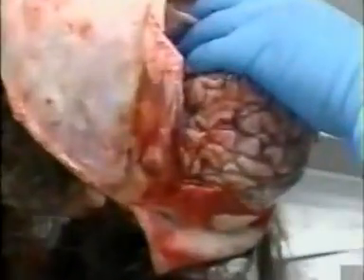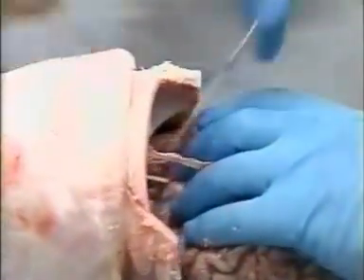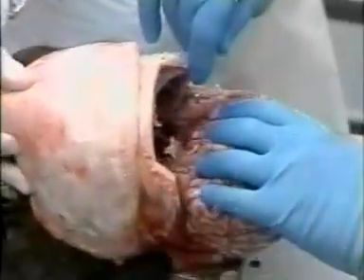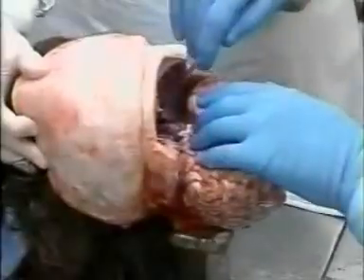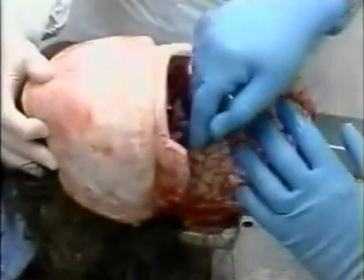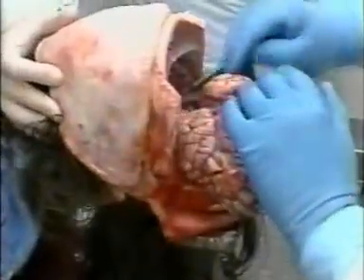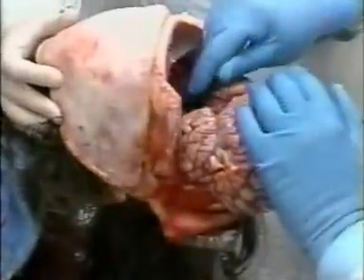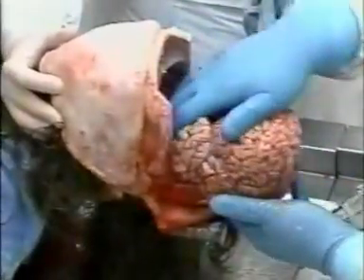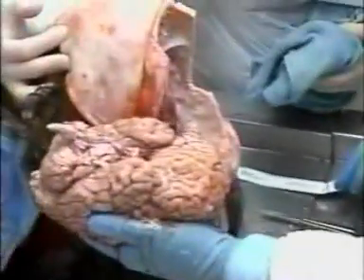First thing he'll do is reach down in and cut the optic nerves. They're the first thing that will be holding the brain in place. Once those have been cut, he'll cut some of the other nerves, and then he'll need to make an incision through the tentorium, which is a tough membrane that holds the cerebellum in the posterior fossa of the skull. Once that's done, he can put his knife down into the foramen magnum and transect the spinal column and essentially deliver the brain.